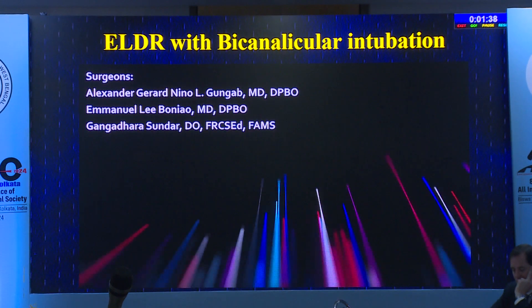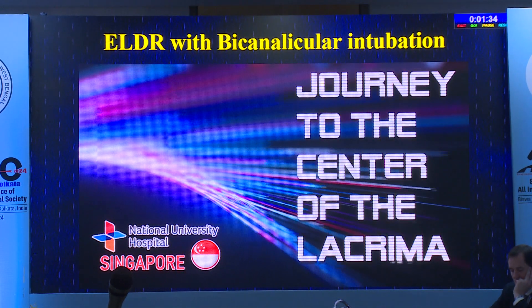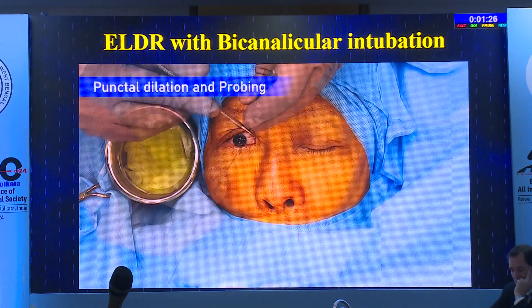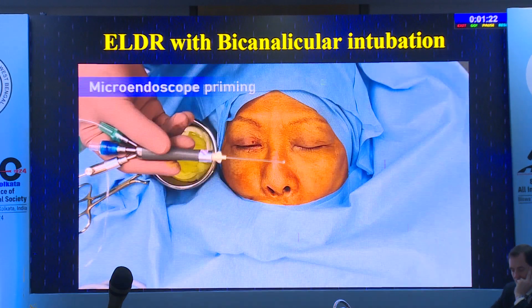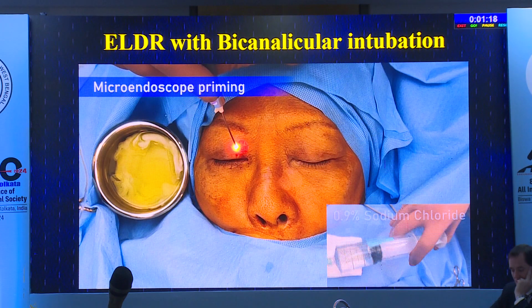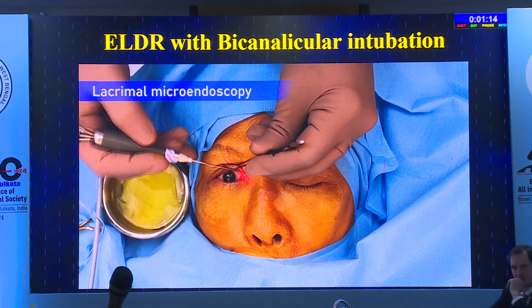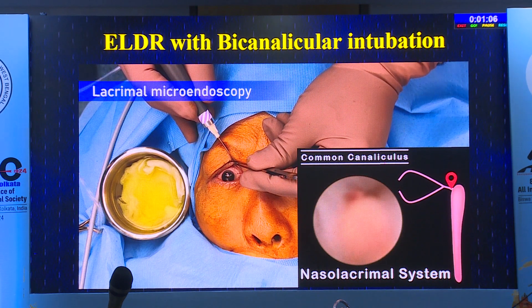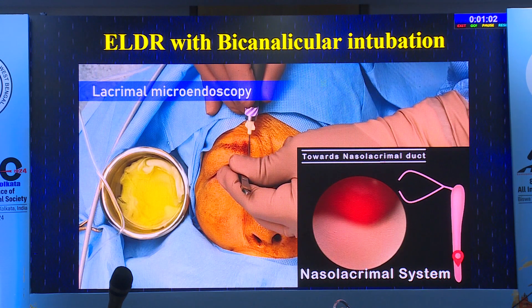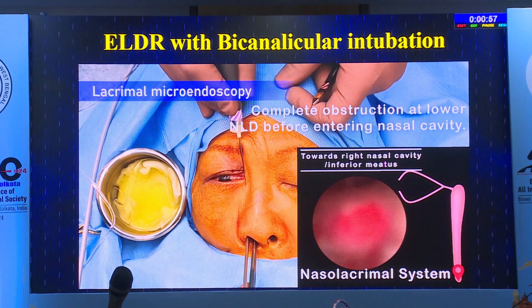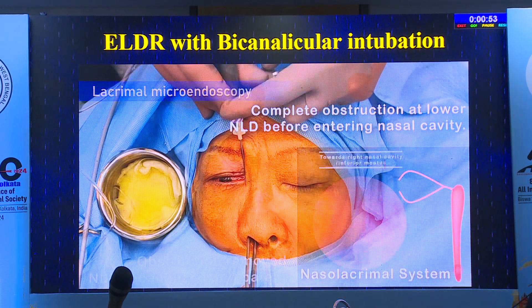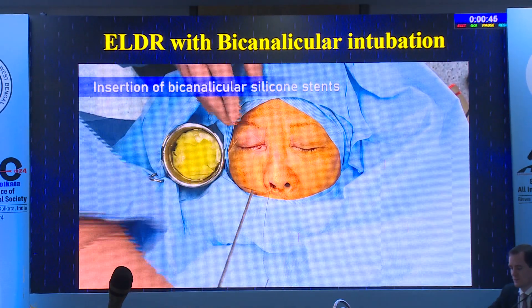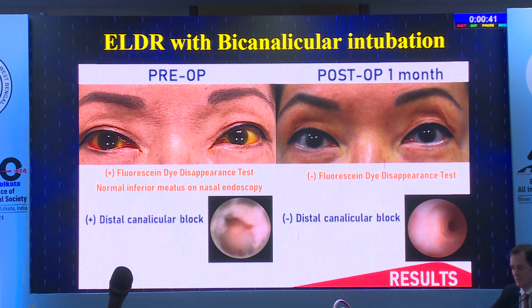Video demonstrating the procedure: endoluminal anesthesia, a three-quarter microendoscope, with a third instrument for mechanical recanalization. Traversing from punctum through proximal and distal canaliculus—very narrow in chronic obstruction cases—into the lacrimal sac, then down the nasolacrimal duct where the obstruction is found. Once found, the shaft recanalizes the obstruction; patency is confirmed with intranasal transillumination, followed by balloon dacryoplasty or bicanalicular intubation.